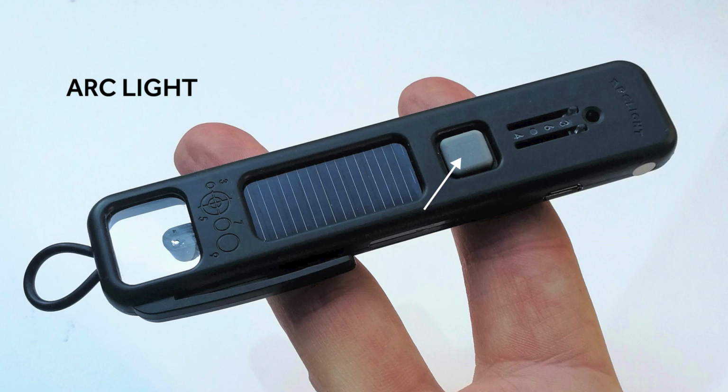The view from this ophthalmoscope is through the aperture on the top of the ophthalmoscope with the adjustable slide set to 0. This can be adjusted according to the refractive error of the patient. As with all examinations, it is important to ensure good hand hygiene before starting and also wear a mask. The examination is conducted in a semi-darkened room.